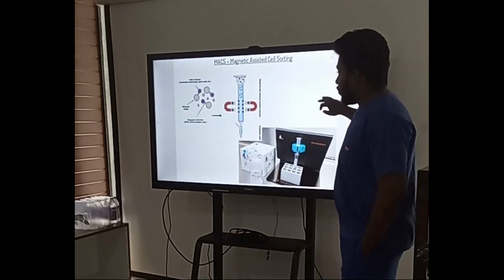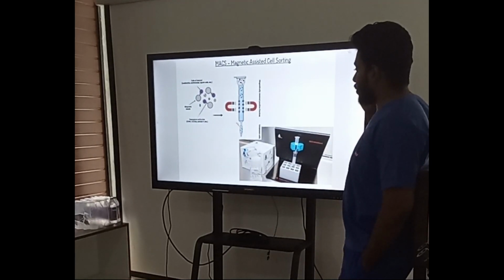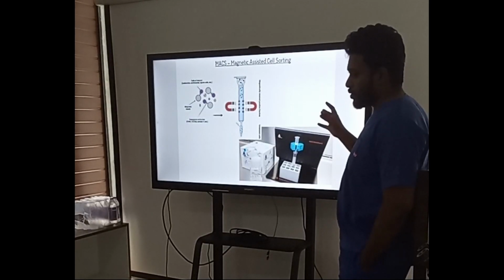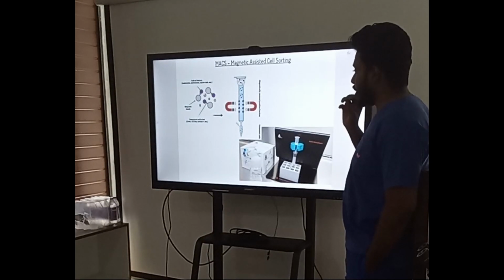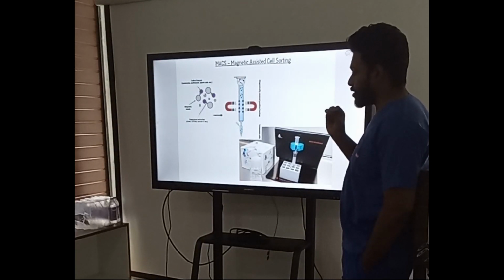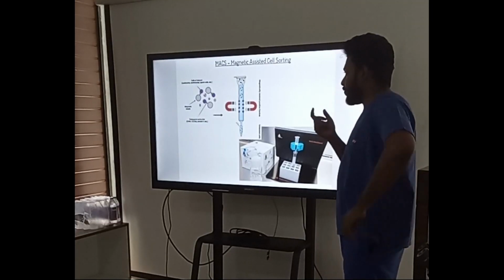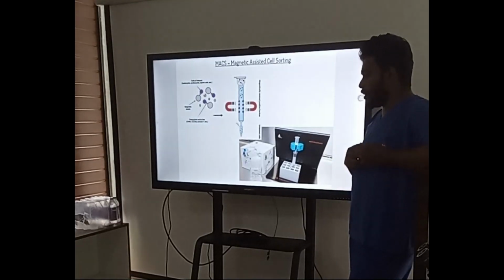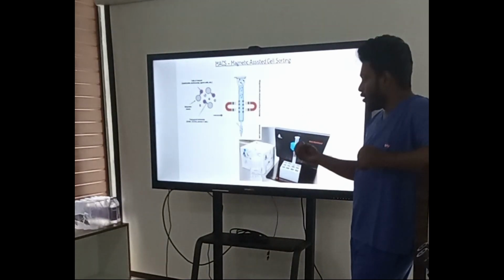There is another way of sperm sorting, that is MACS. It is very beautiful; this is actually implemented in cancer biology to extract only the cancer cells, because every cell has cluster of differentiation (CD) proteins on the surface wall. When the sperm is undergoing apoptosis, it has phosphatidylserine, a protein which is protruded from the intracytoplasmic to the extracytoplasmic side.